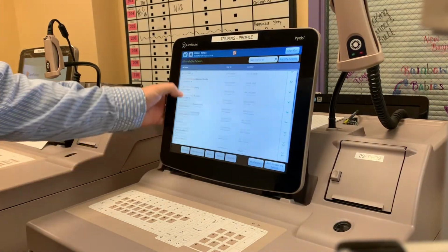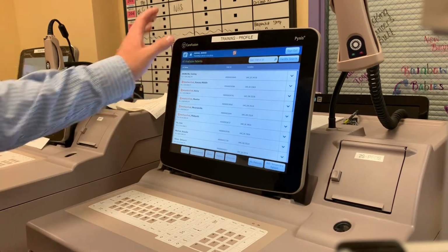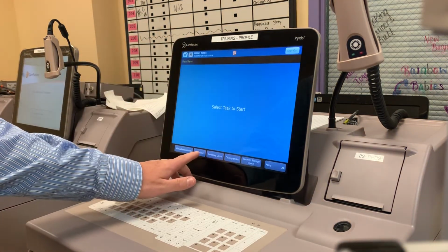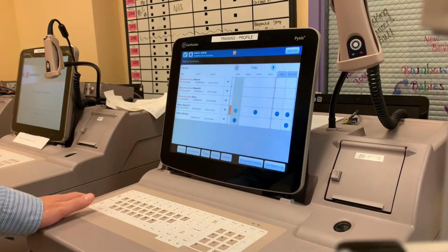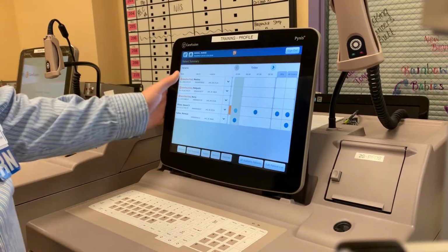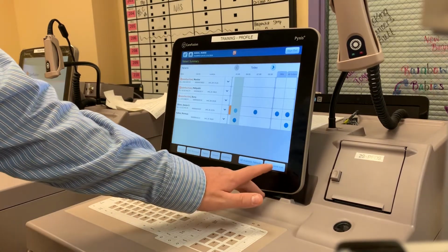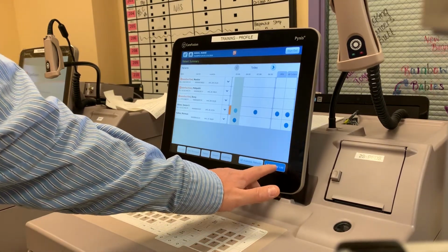So I'm back in all available patients. There's another functionality called My Patients that you have. If we're on the home screen, it's the next button over going left to right. You can create your own little status board for the day. I have these 5 patients here. Maybe I'm coming in and I have only 2 of them from yesterday, and then I'm going to change out 3 of them. So there's an edit patient list here over the bottom right.